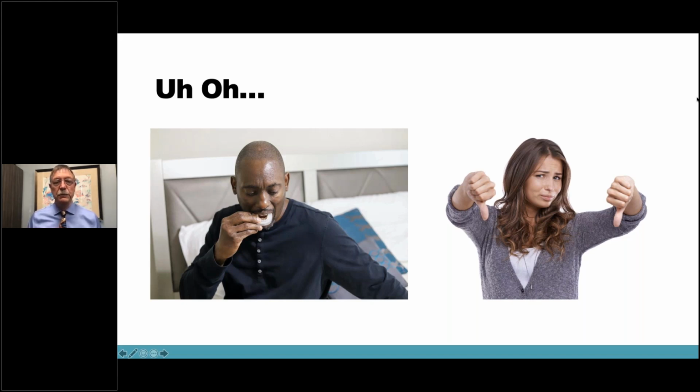So now we get depressed. We can say, wait a minute, what are we going to do? Do we think about another appliance? Do we think about advancing it more? Do we think about changing up the device for some reason? Uh-oh, do we think that we should send them back to CPAP just because they come back and say that it's not quite working? Well, I want to remind you about something.